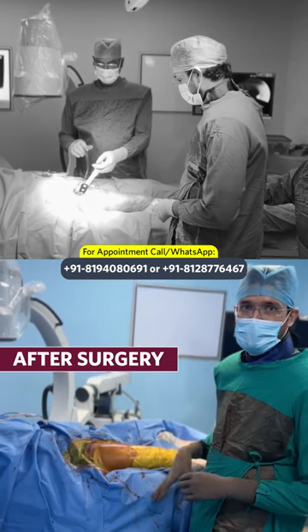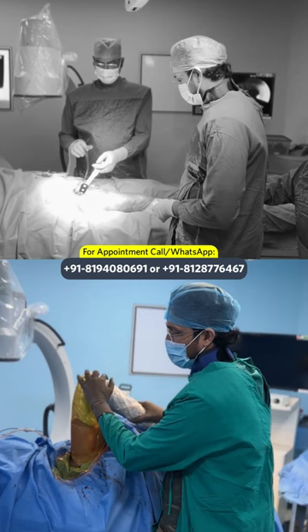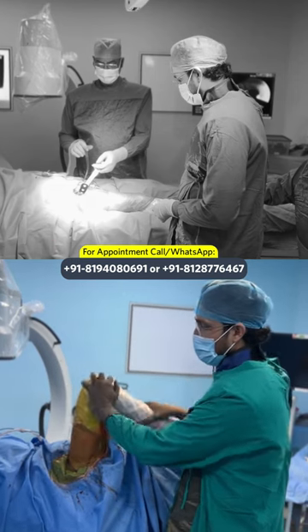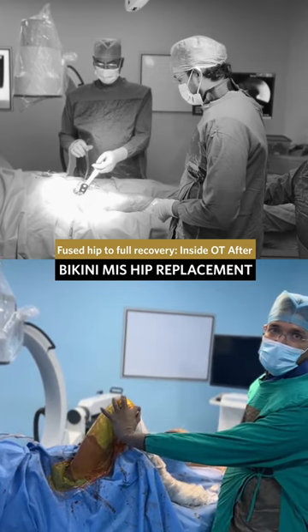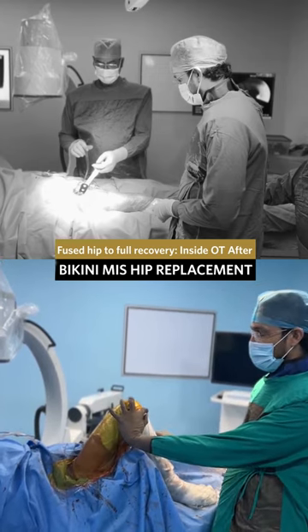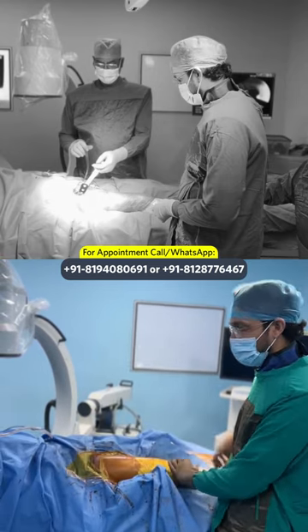We have done the MIS bikini THR of this patient on the right side. We are now able to flex it for more than 100 degrees and all rotations have come back. The other limb is getting up due to a fixed deformity in that hip, but this side has corrected and the patient has regained full movement inside the OT.